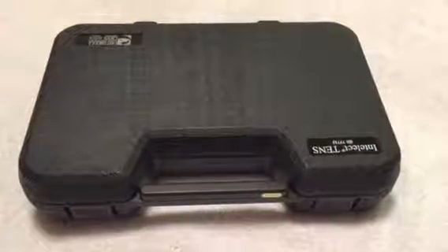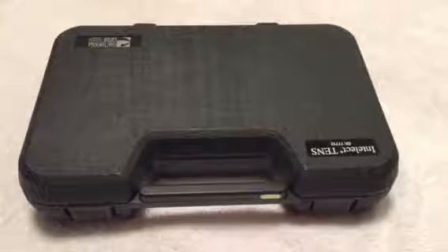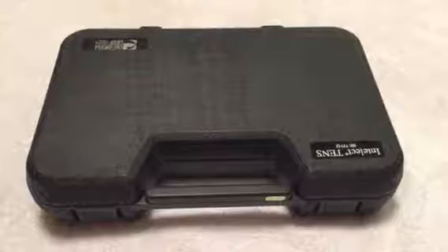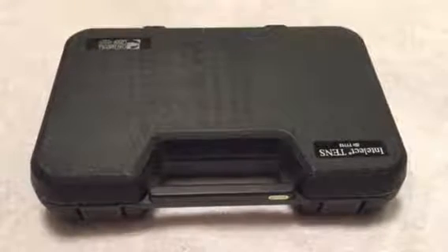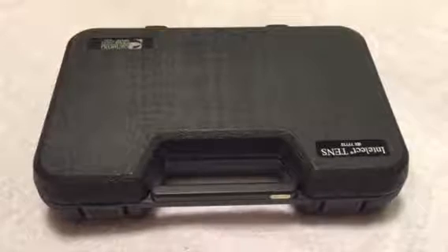Hi and welcome to training on our new TENS units. The Inpatient Rehabilitation Department at UC Health North is excited to collaborate with the birthing centers to make sure that everyone feels more comfortable with assisting our patients when they're using TENS for pain management during labor and delivery.